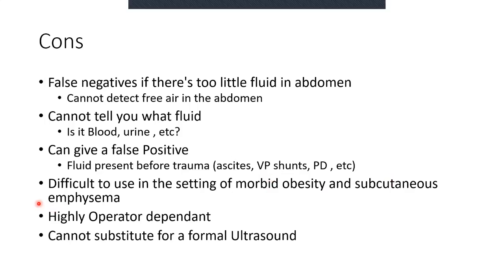And the other thing is subcutaneous emphysema. So a patient has subcutaneous emphysema, that air that's now trapped in the tissues is creating a similar effect to what we would have seen in the pneumothorax lecture. It basically collects that ultrasound beam and dissipates it, so it gives you a very weird returning image, all right?